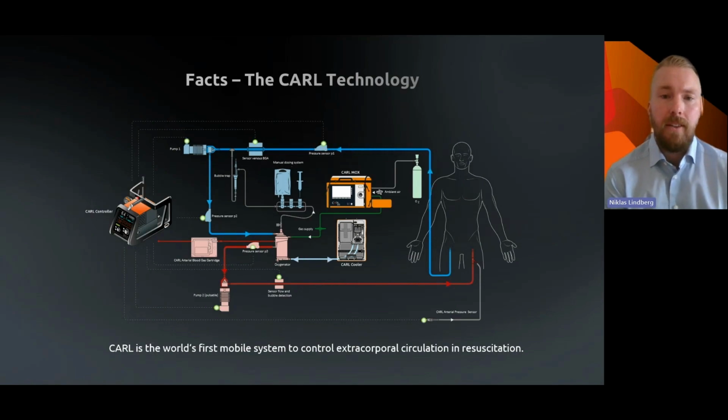From the oxygenator, the pre-ox side above, on top of the oxygenator, we have the possibility of applying a manual dosage system. That dosage system is intended to be used for applying vasoactive drugs, continuous heparin infusion, or maybe if you want to have some additional volume to the patient.